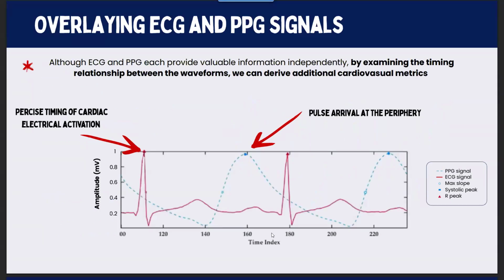So when looking at these two waveforms, we talked about their similarities, but really when they can be best used, in my opinion, is in tandem with one another.